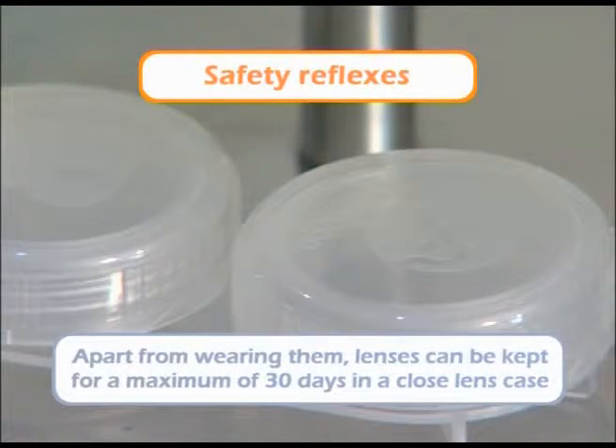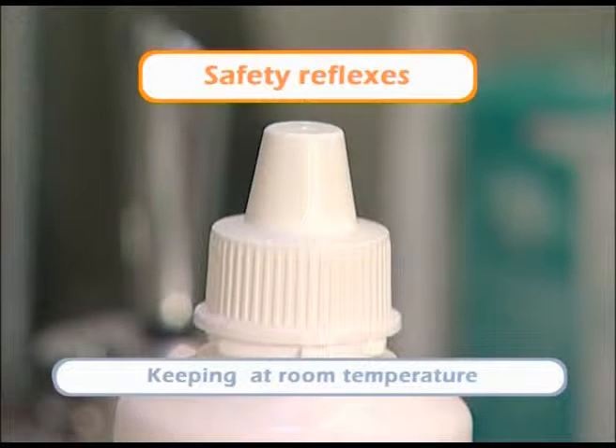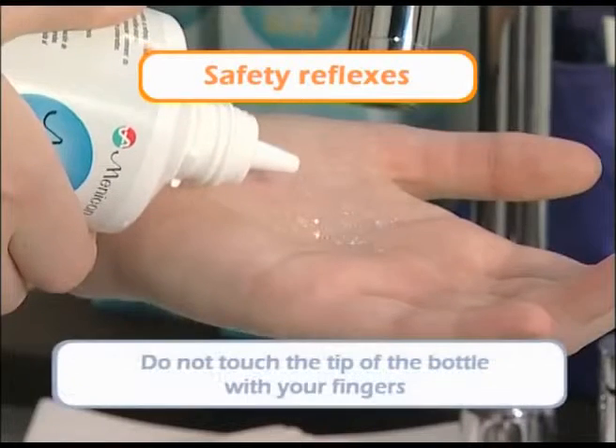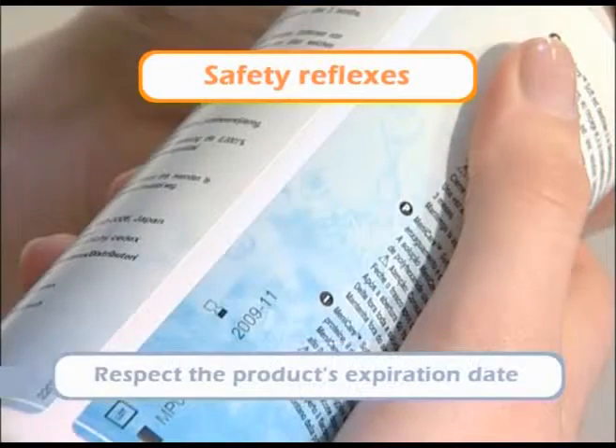Apart from wearing them, the lenses can be kept for a maximum of 30 days in a tightly closed holder. Close the bottle after each use and keep it at room temperature away from the sunlight. Do not touch the tip of the bottle. Respect the product's expiration date and throw it away after three months of use.